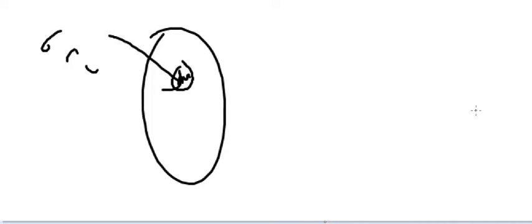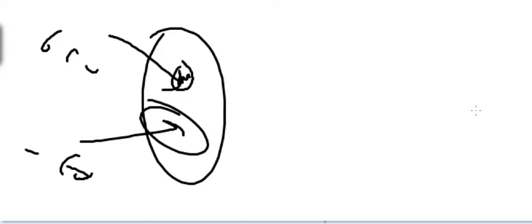So if I put the cursor on something here, for example, and it shows me minus 60, I know this is fat, for example a lipoma. What about soft tissue? Is soft tissue more or less than water? It's a little bit more than water. So it will be around 50, 60, 70 Hounsfield unit, positive 60, 70. So I can use it.